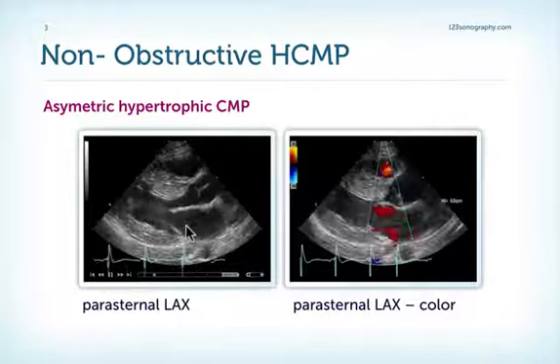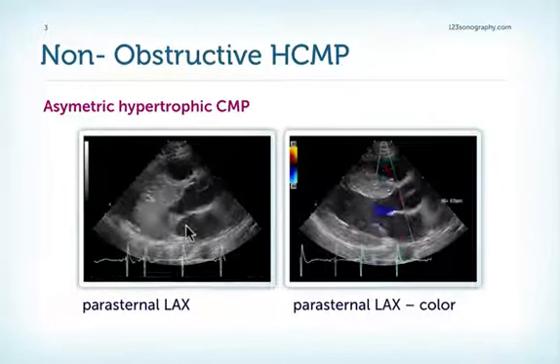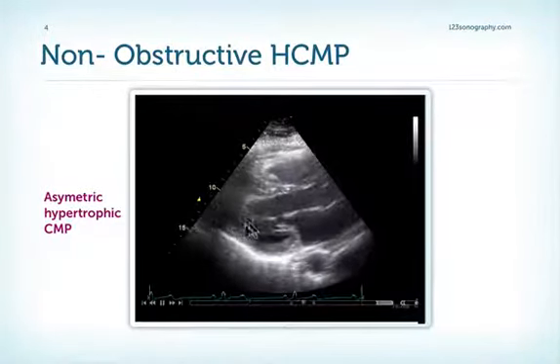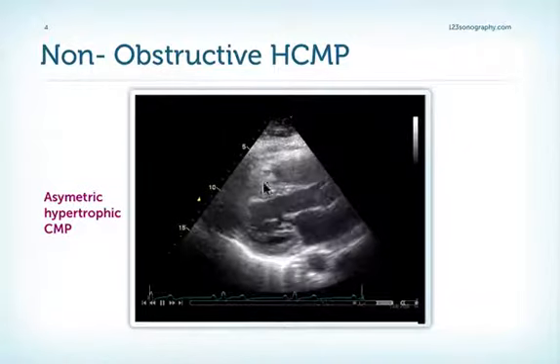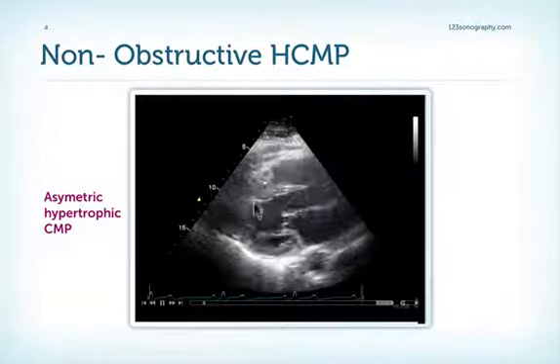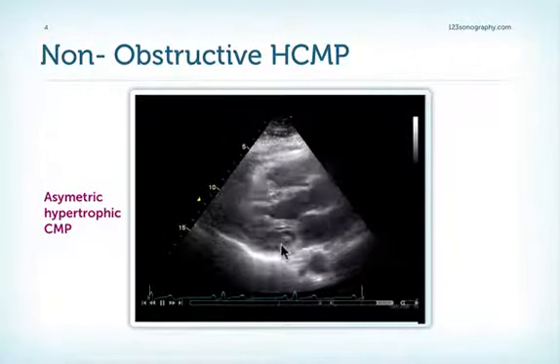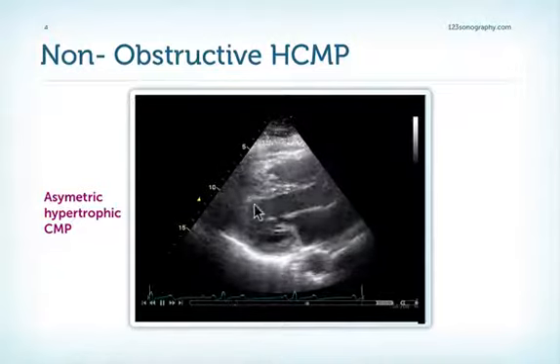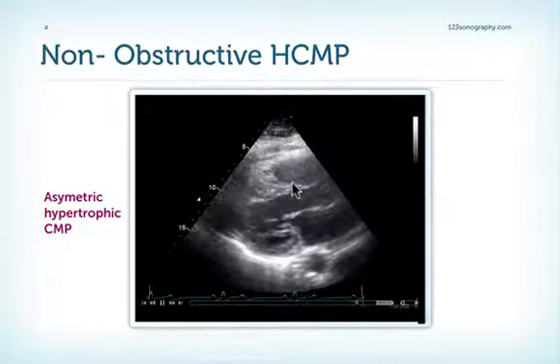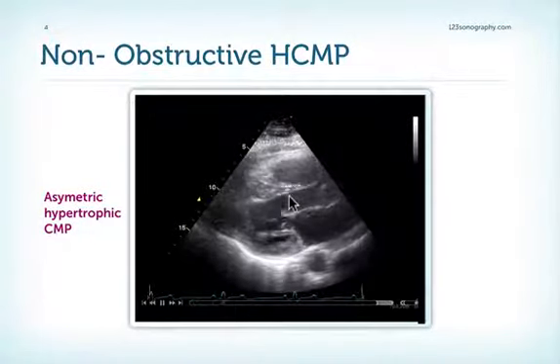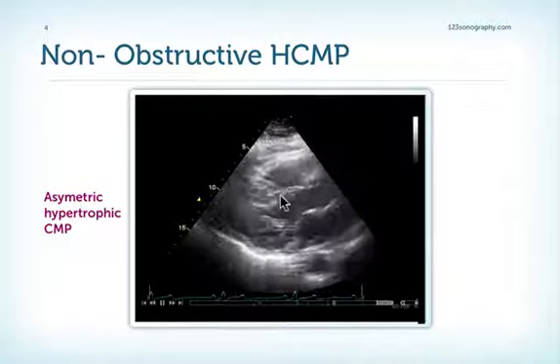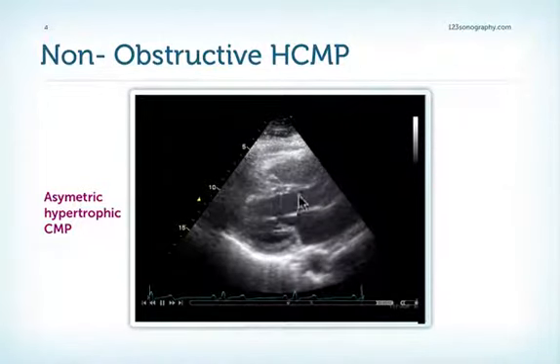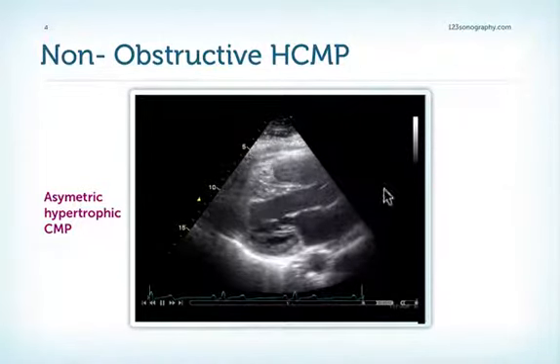We'll talk about the SAM or systolic anterior motion phenomenon later. Here is another example: you can see that the septum is much thicker than the remaining portions. The mid-septum is thick and not the basal portions. So this too is a hypertrophic cardiomyopathy, an asymmetric type.